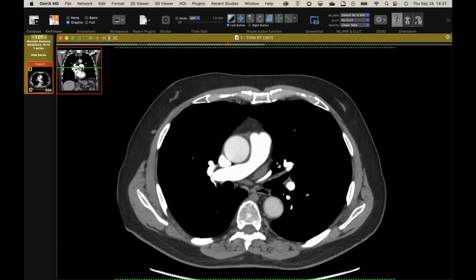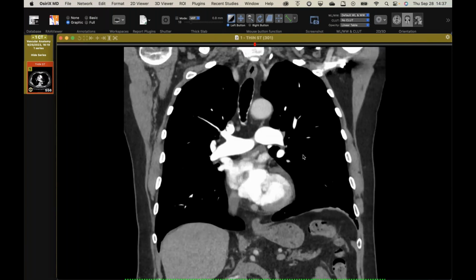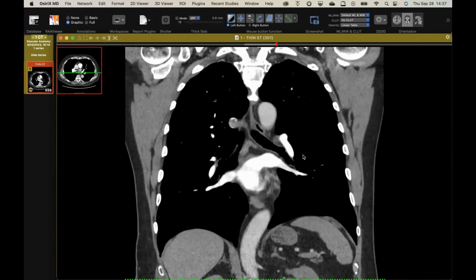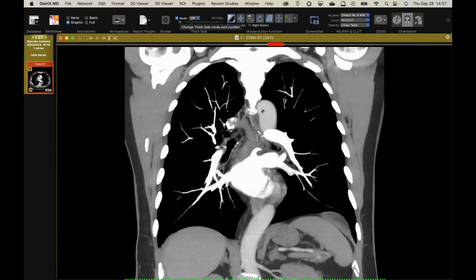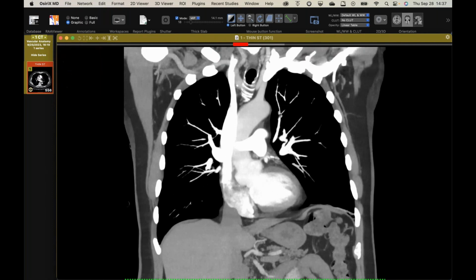But I don't know. I've never seen anything like this. Have you, David? No. Jeff, what does the airway branching pattern look like? It was normal. I looked for other congenital things and couldn't find any. But here it is right here. You can follow it there, and it just loops up right there.